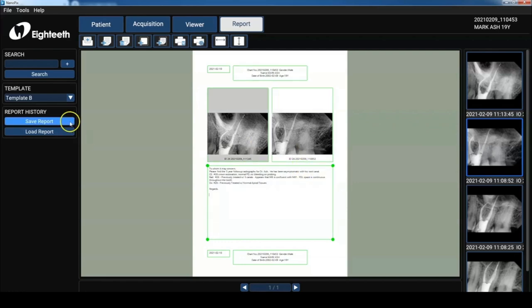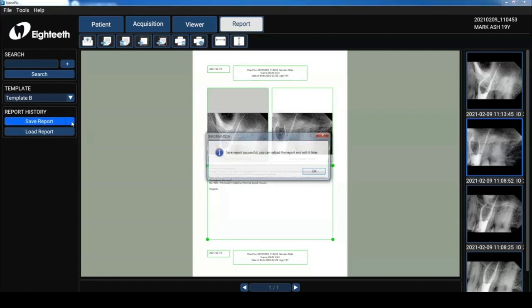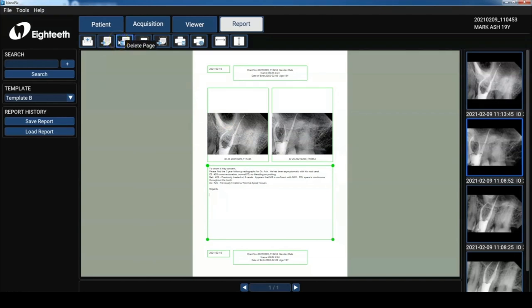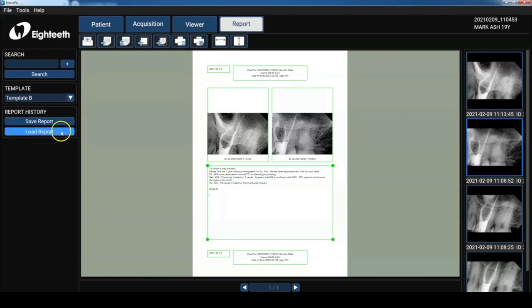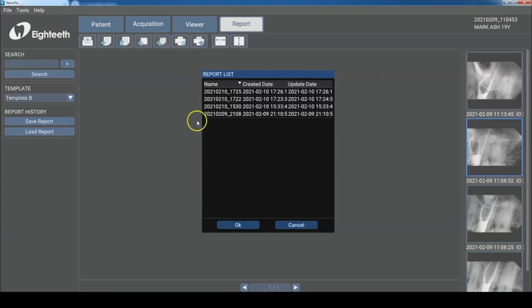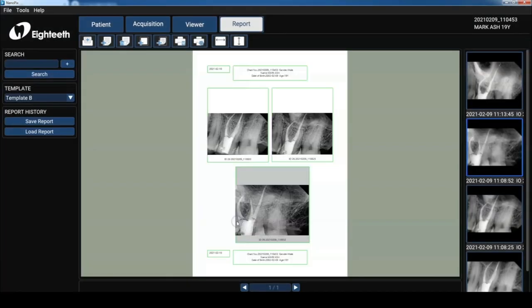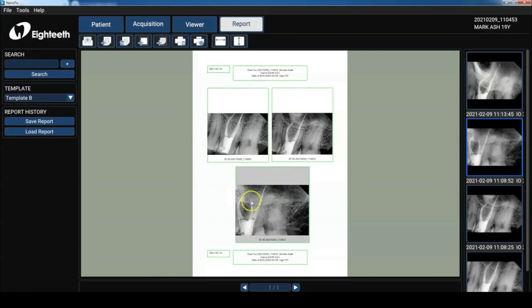So from here, I can save the report so I can access it down the road. I can also add a page to it. I can delete a page and I can add an image box and a text box and customize the report to the way I need it. Let's load up another report that I've modified and here you can see I have three image boxes and it was really simple to do this. And that's how simple it is to use the report screen.